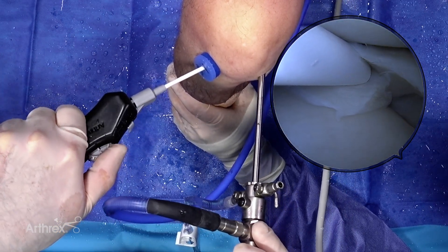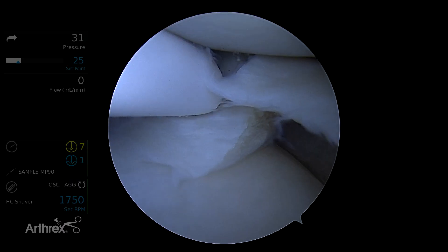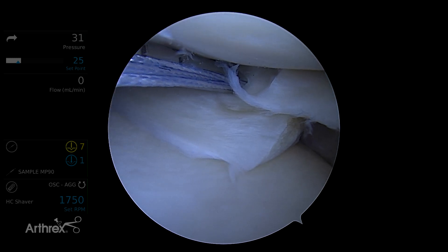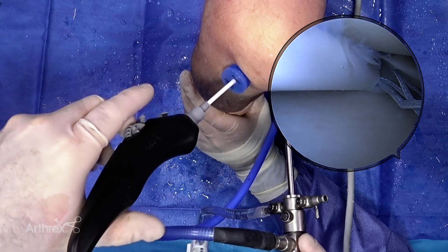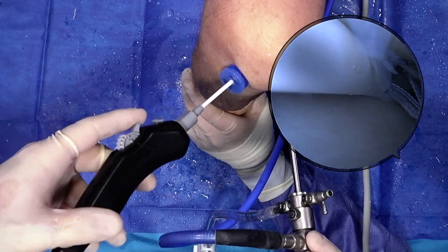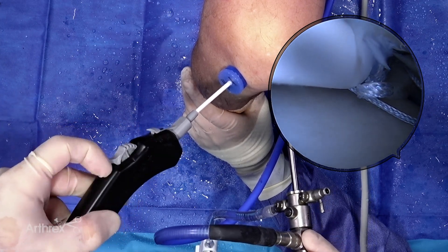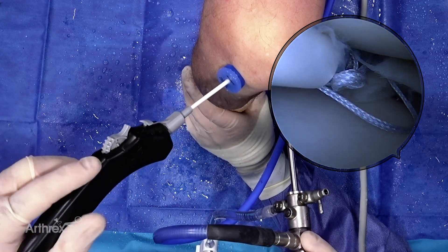So the first all-suture anchor has deployed. I pull out. Making use of this curvature, I'm aiming down on this one, getting that tip to go in. Hard stop — I'm going to roll back, hard stop, then roll forward, hard stop. Pull out.